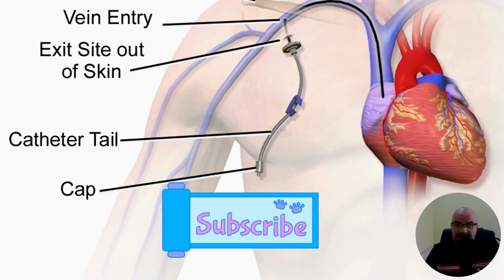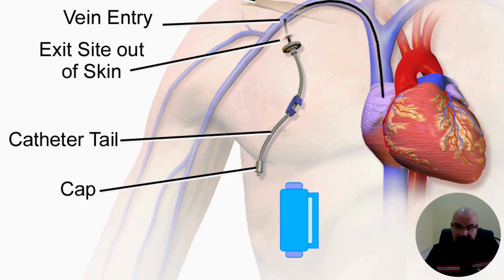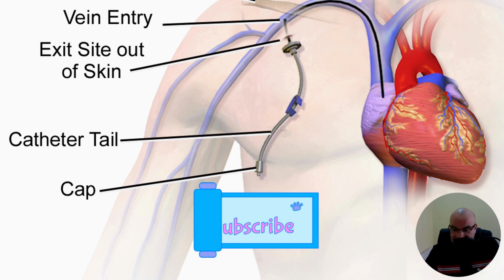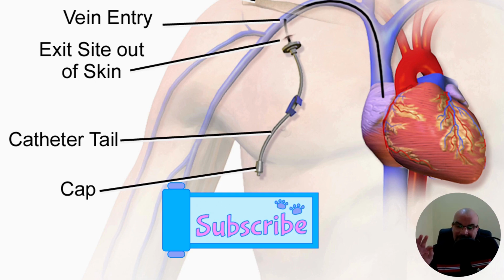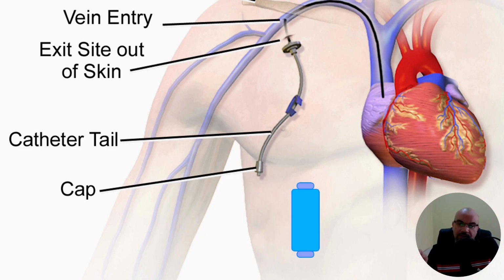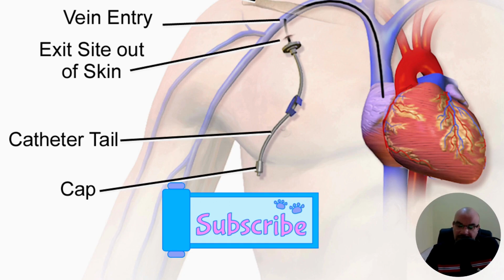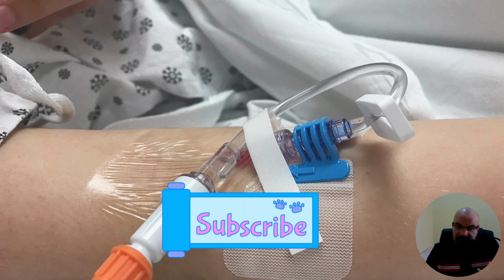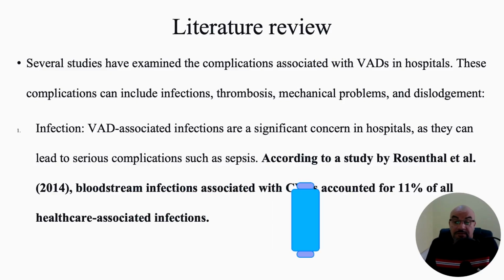In fact, IV cannula can refer to all vascular access devices, and this is what is commonly used. This is an example of the central venous line, which is inserted in a large vein and has its own tip. It is like a plastic tube, with a part of it inside the vein and part of it outside, and this is the way of communication and dealing. This is like a long line which starts from the arm or leg and ends in the major vein.